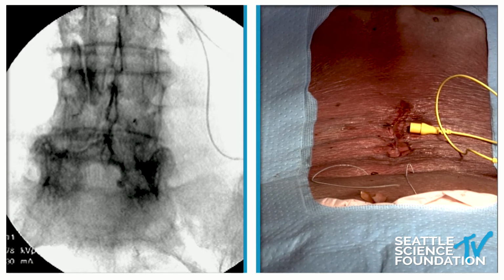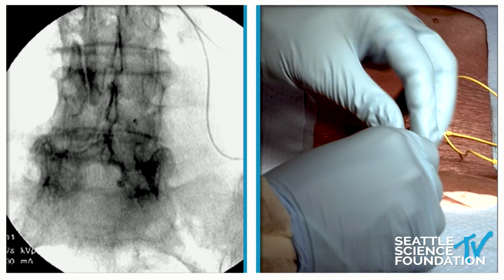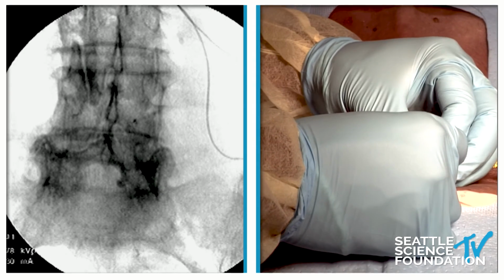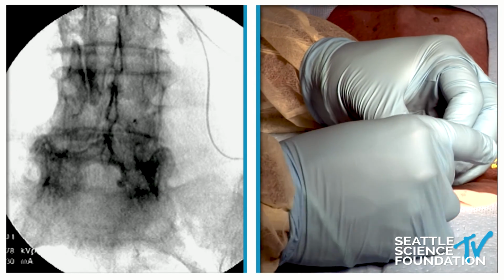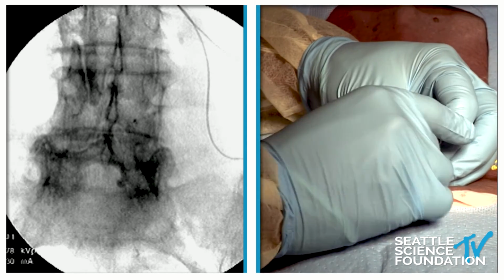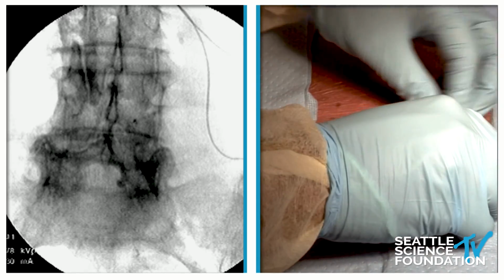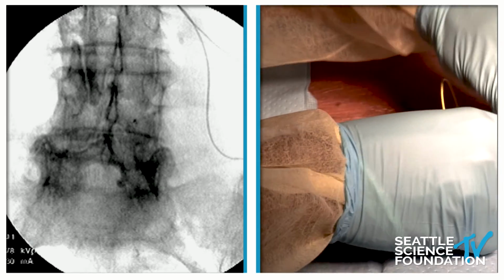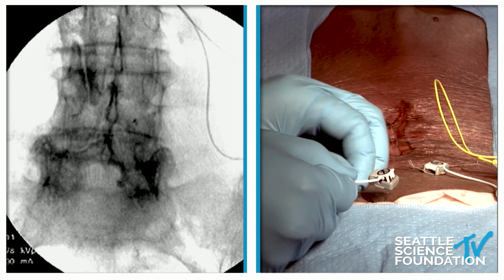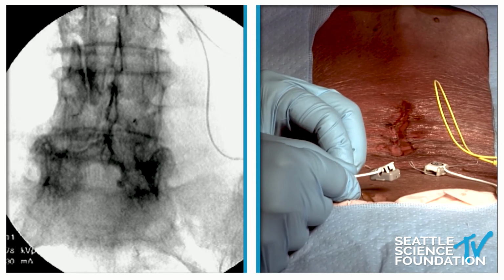And now we'll take our connector boxes, put them down. And this is the part where you need to have decent eyes. So you take that micro lead and you push it out the back. There we go. You take it down to about 2.5 centimeters, snap it down, and then there's a splitter cable, but we don't need to deal with that right now. Do it to the other side. Again, just good eyes here.